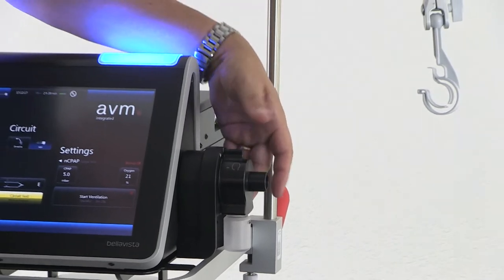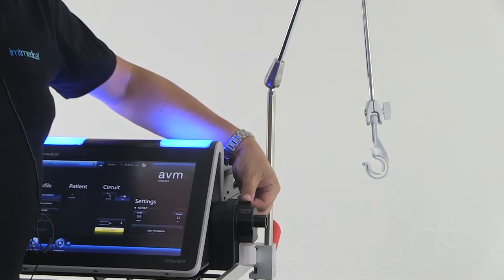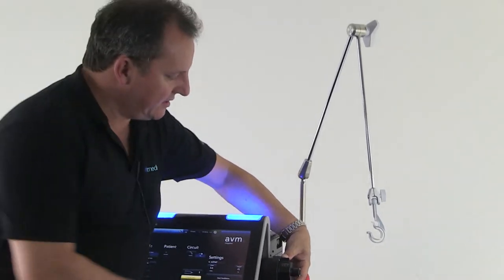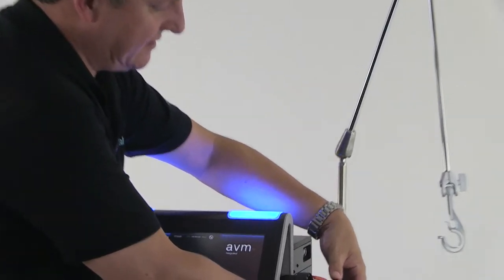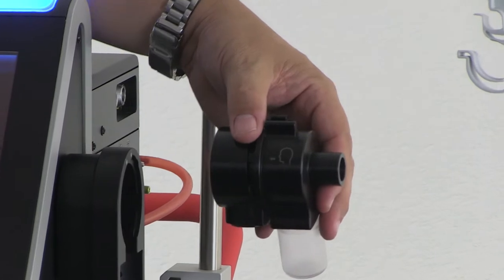The integrated exhalation valve has the jar and where my thumb is here there's a lock button. You press the lock button, rotate the jar towards the rear of the Bella Vista, and the exhalation valve comes out of the Bella Vista.